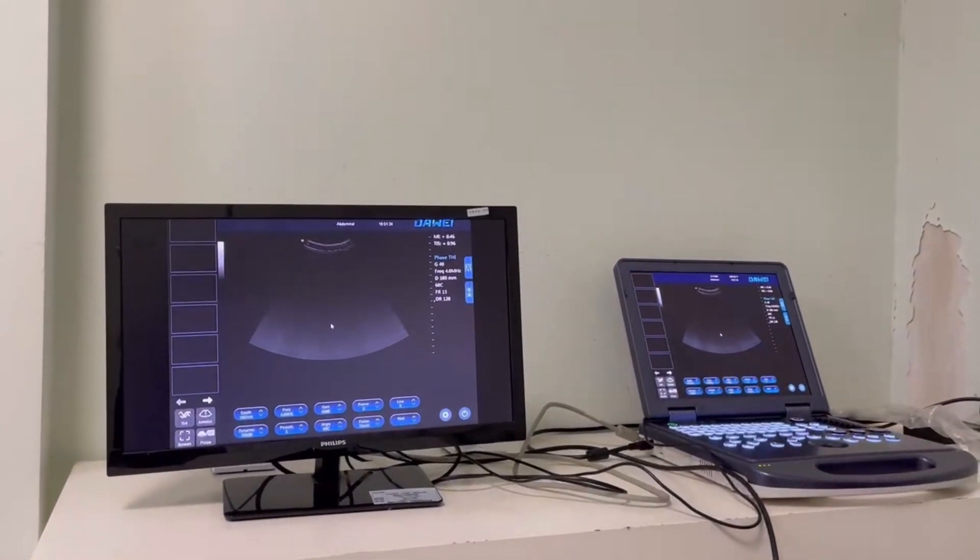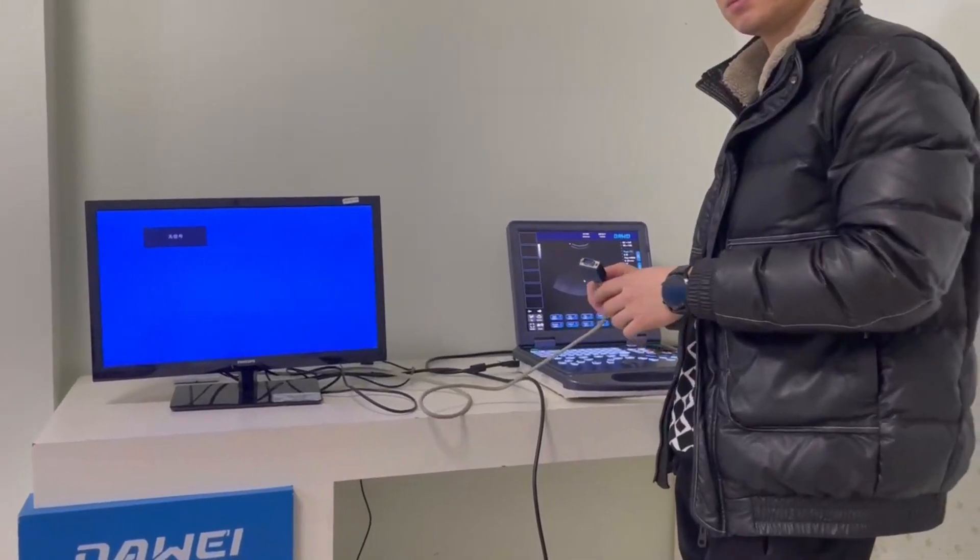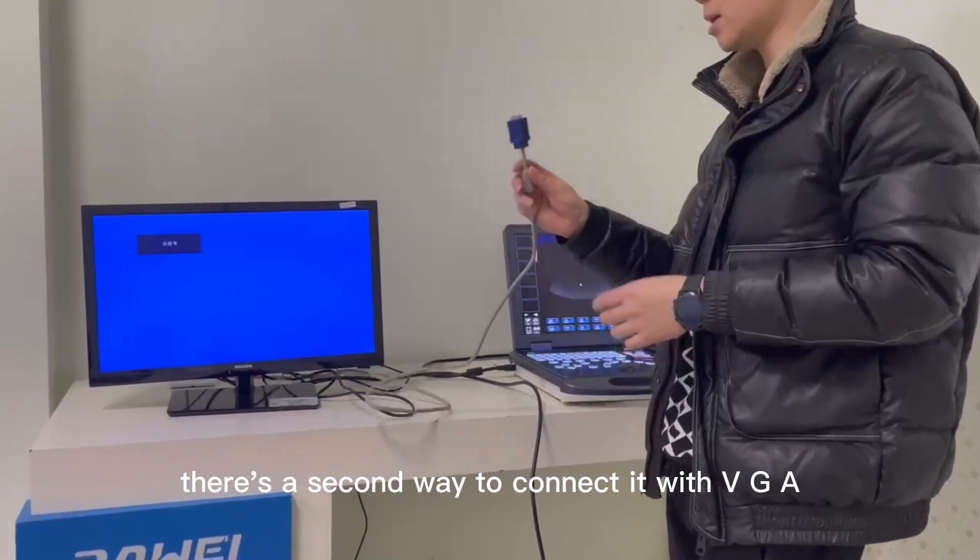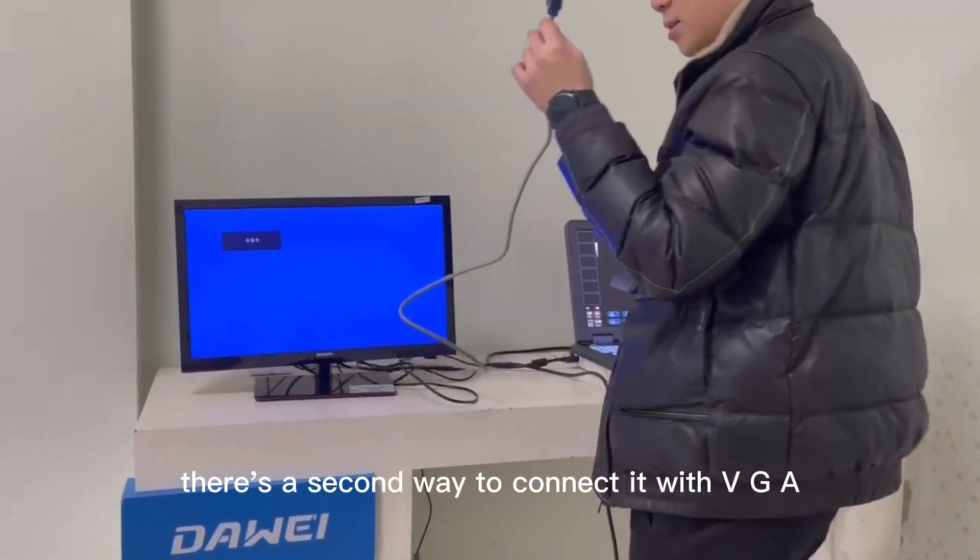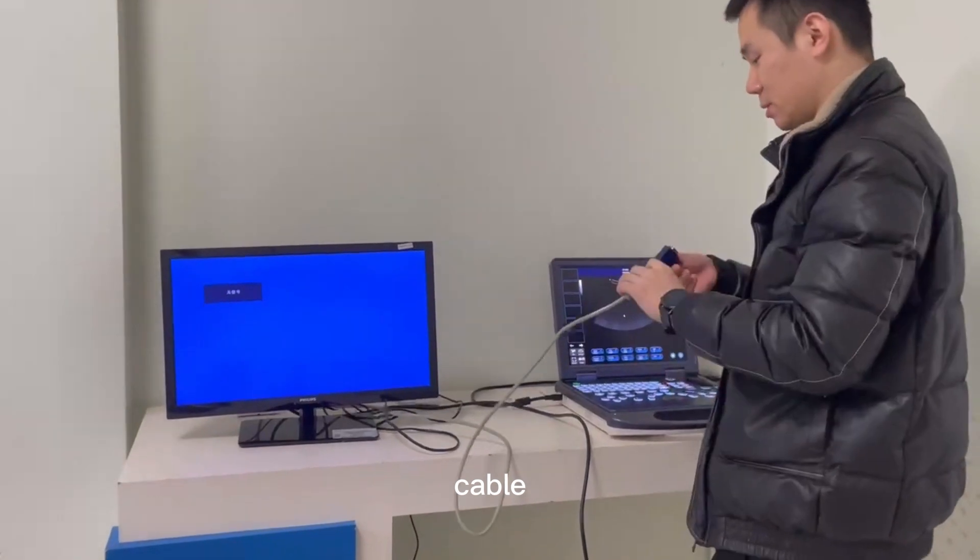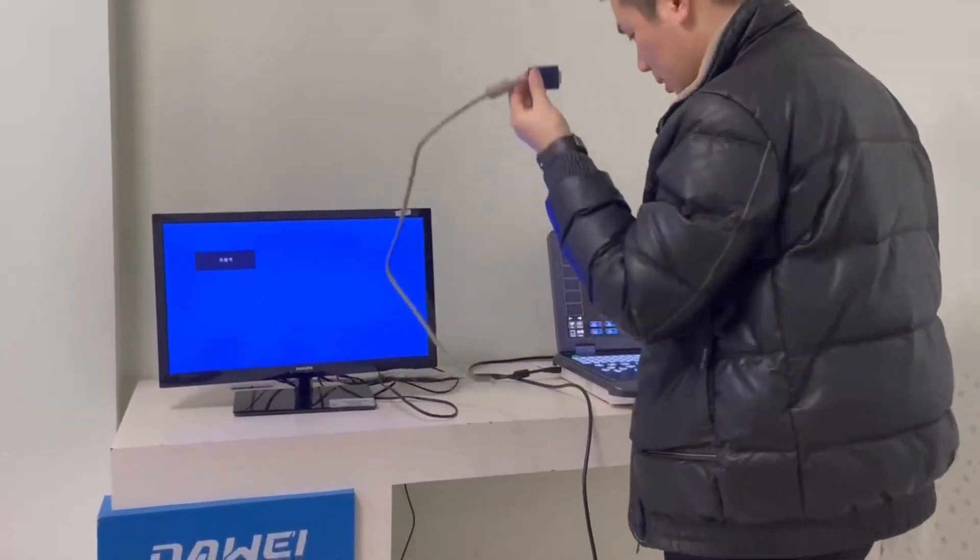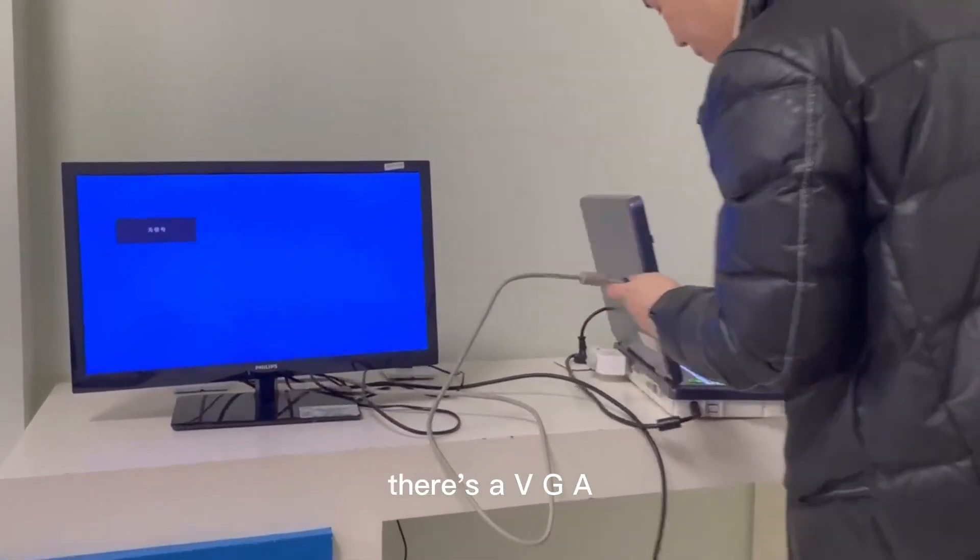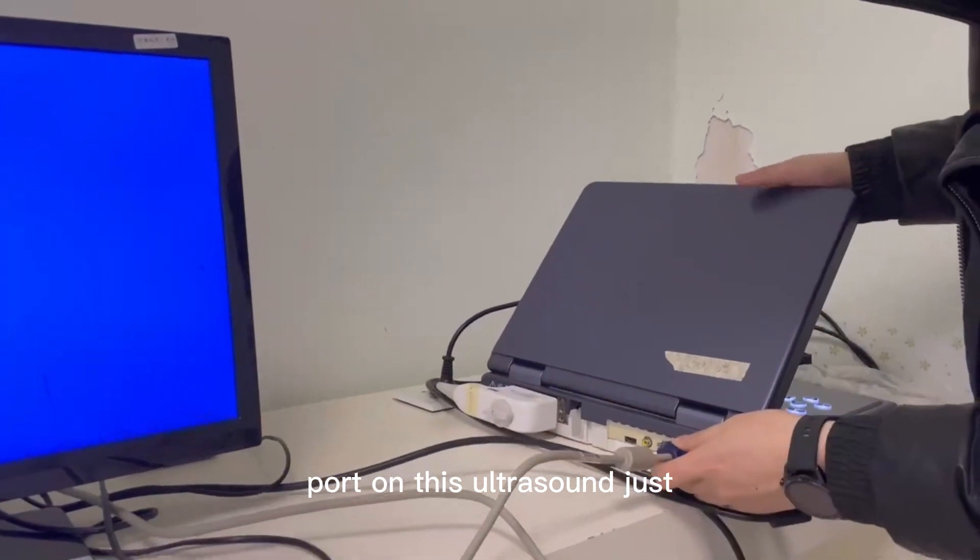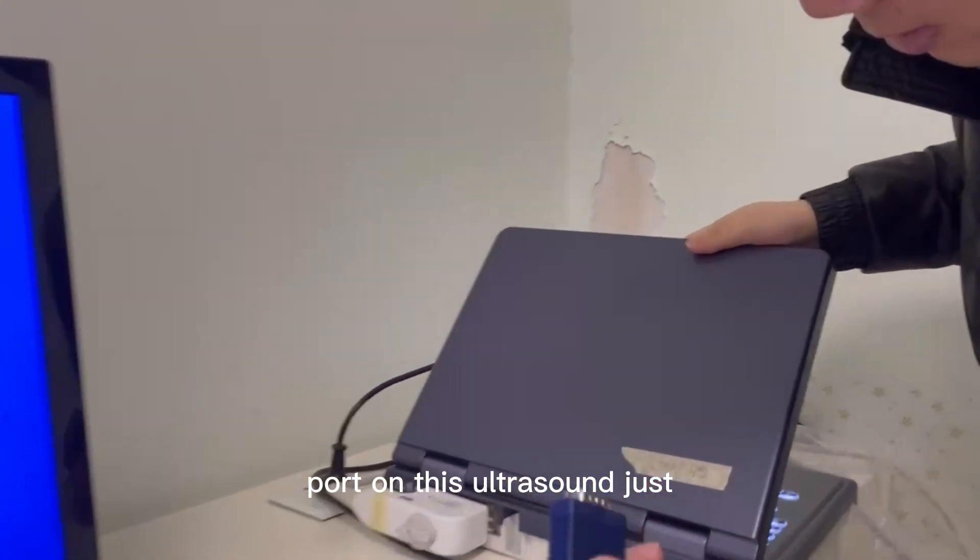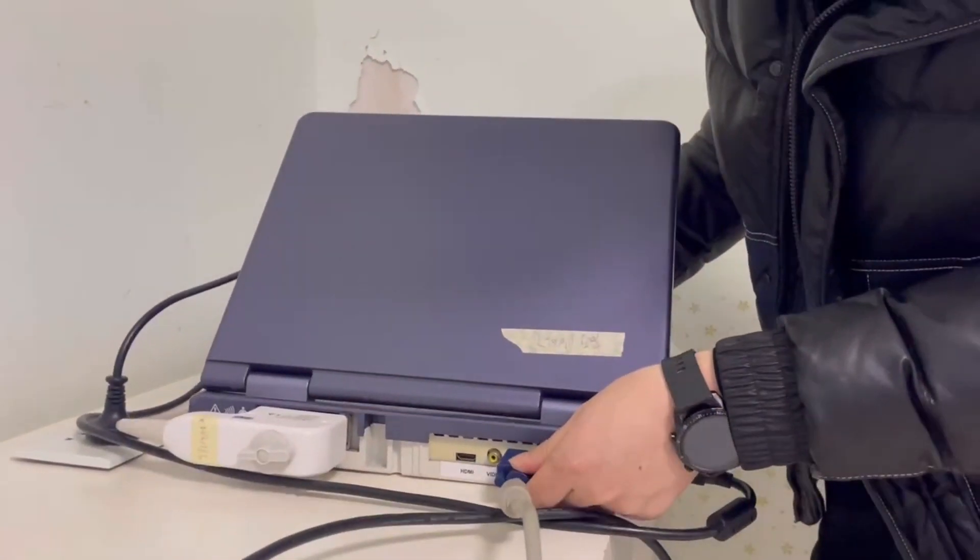There is a second way to connect it with a VGA cable. Like I showed you, there is a VGA port on this ultrasound. Just connect it.